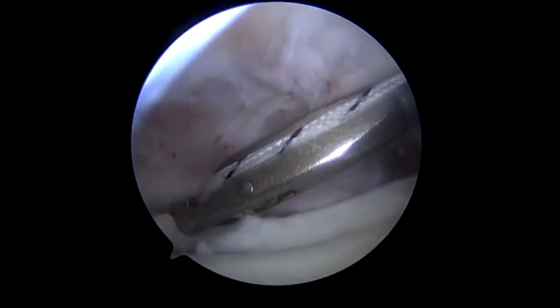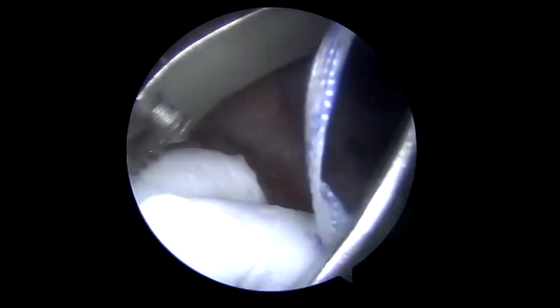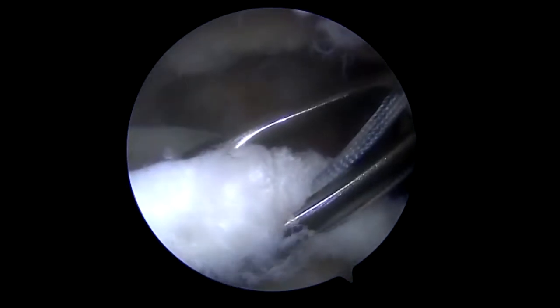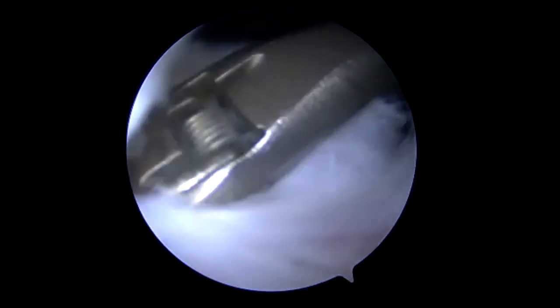We are now cutting the sutures from the superior glenoid rim, and you can see that the graft is quite tight. In order to give improved coverage, we can now take the remnant of the cuff. In this case, a small portion of the infraspinatus was remaining, and we are passing suture tape through the posterior margin of the dermal allograft, then grabbing a portion of the remaining infraspinatus.